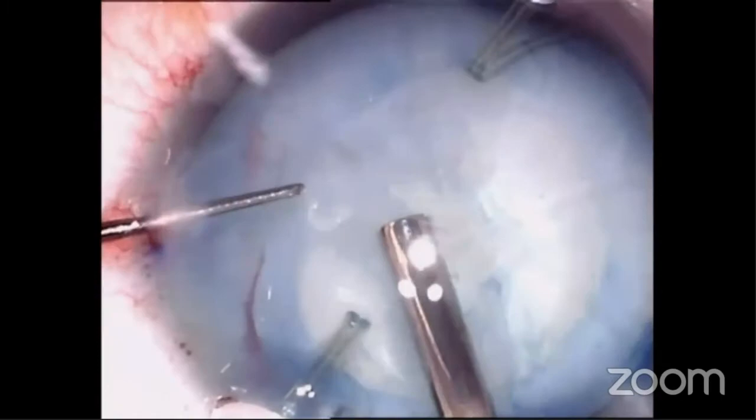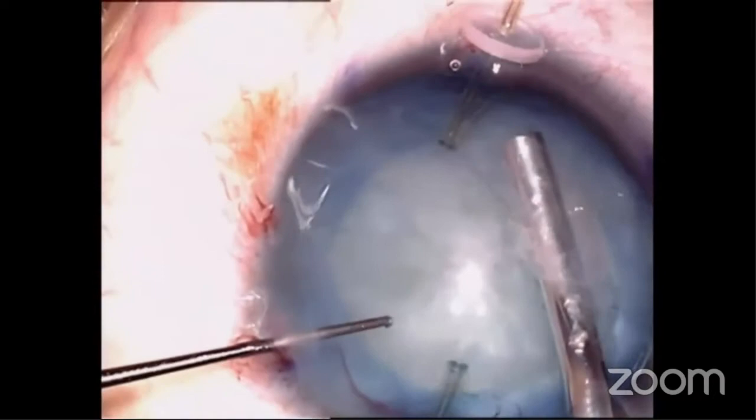After creating an adequate size capsulotomy, we are then supporting the equator of this lens bag with a capsule hook and then expanding the equator of the capsular bag in the plane just under the anterior capsule that has been cleaved by viscoelastic. Because the lens is soft, we aspirate after supporting with four hooks, and then before we move on instruments, we put in viscoelastic. And you can see the vitreous cavity is all stained with VisionBlue.